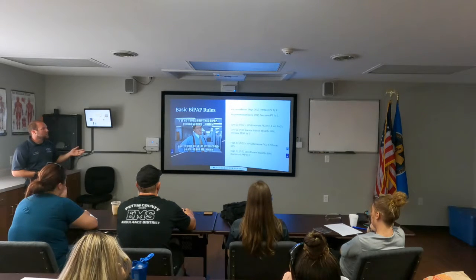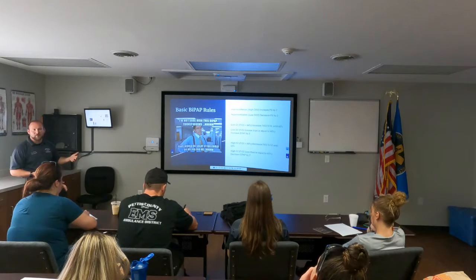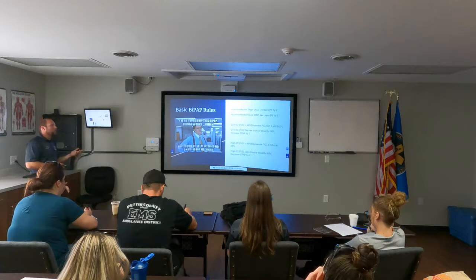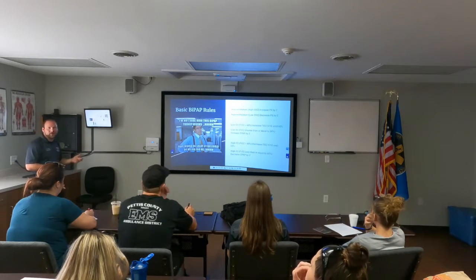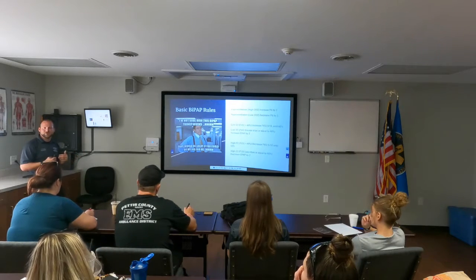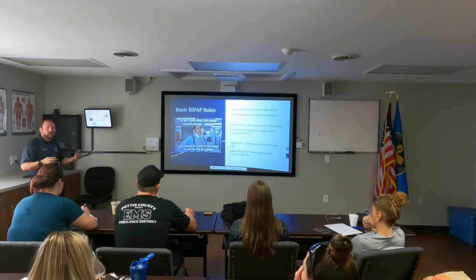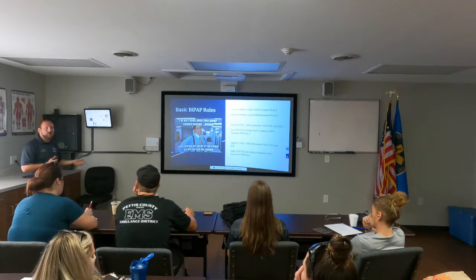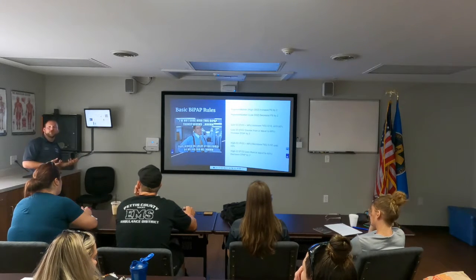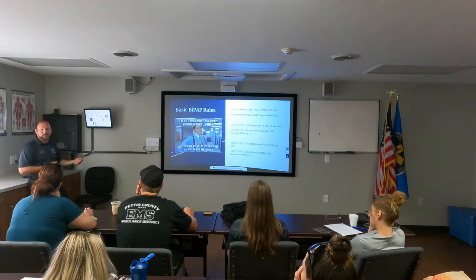Now, if we have a high O2, our FiO2 is higher than 60%, we can decrease it by 5 or 10 so we hit 60. Or if it's less than or equal to 60, decrease your EPAP by 2. That's where we're going to originally want to start with our settings, making our changes and seeing how improvement goes from there. Now, the frustrating thing for us is that we do not have access to ABGs in the field, but we do have our monitor, we have end tidal, we have patient presentation to help us determine if the settings that we're going with are moving in the right direction.